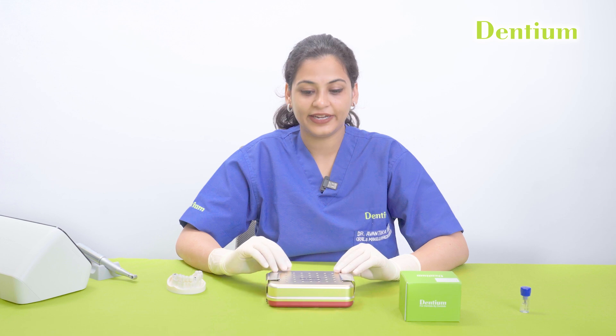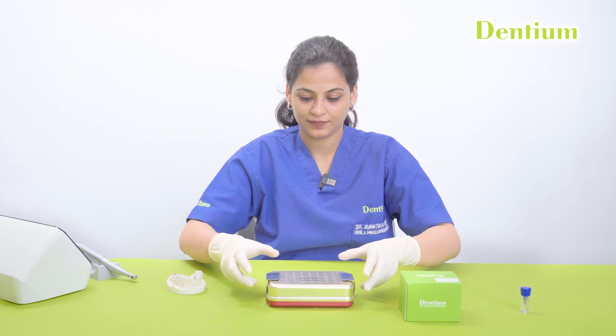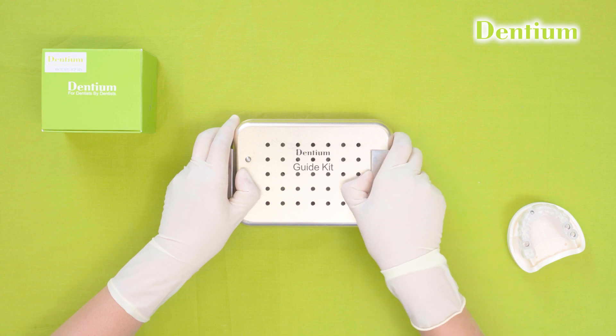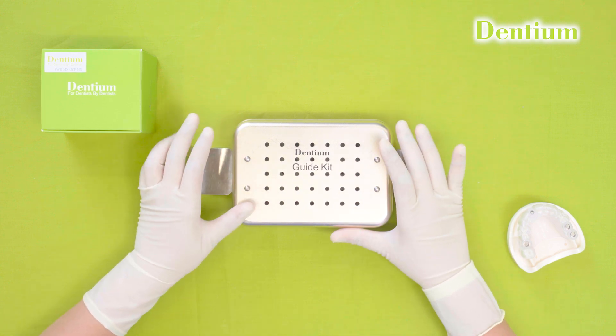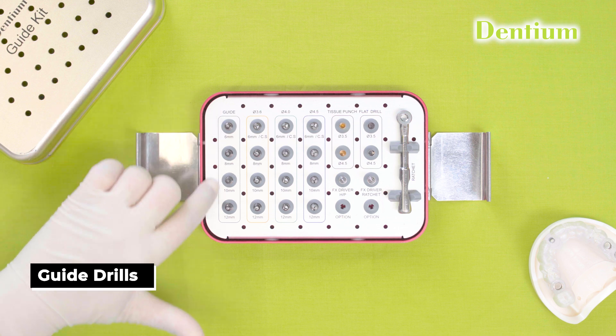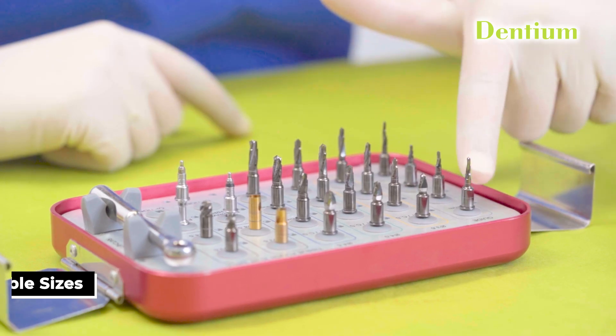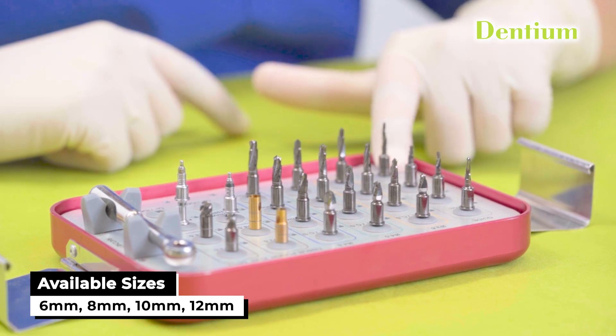So let's get started. This is the Dentium Superline Guided Surgery Kit — let's see what is inside. These are the guide drills. The diameter of the guide drill is 2.3 mm, available in 6, 8, 10 and 12 mm.